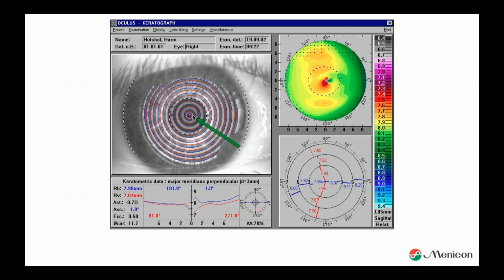We paid such an amount of money for the topographer that we want to see behind the device what is actually happening. So there is a camera there as well. So in the center area, the topographer is actually not measuring something. It is just completely blank. So it is interpolating.